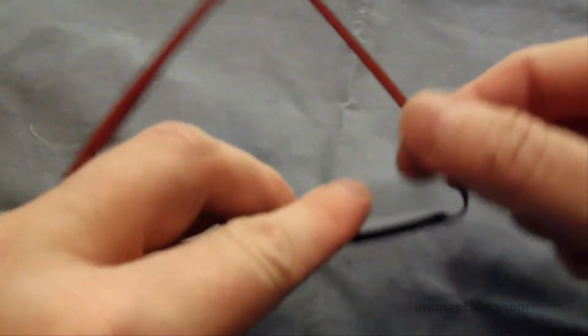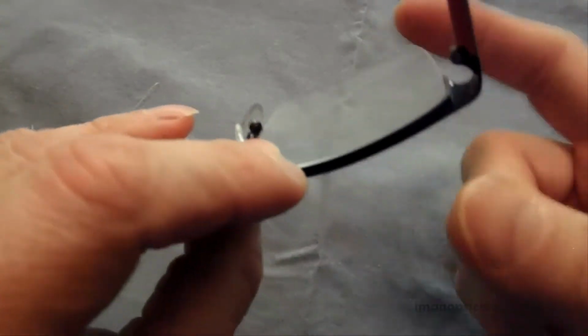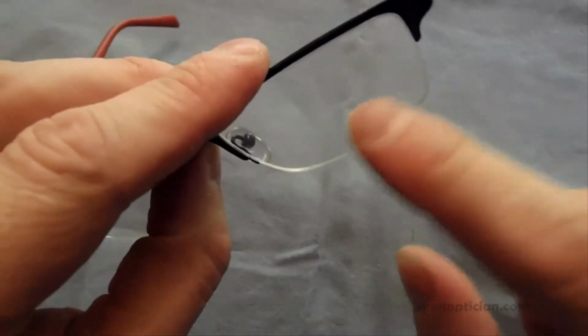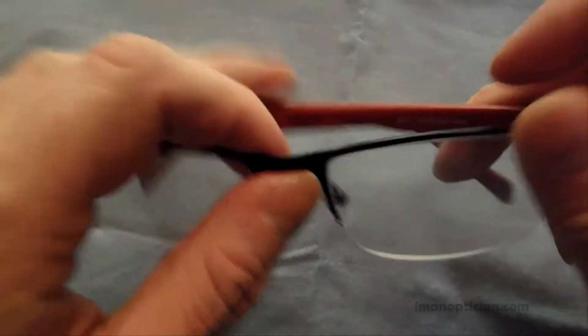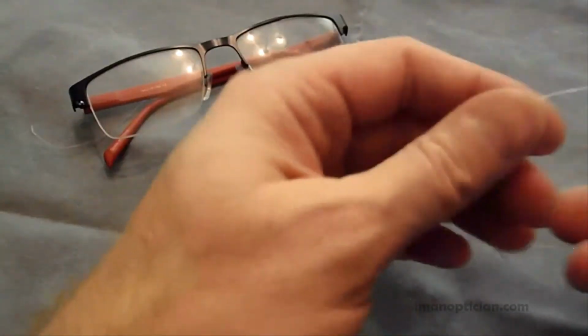Or if you have a frame warmer handy, you can just get a little heat on here, just turn that frame warmer on, stick that underneath, and this will shrink right up and be nice and tight. You can actually do that with the lens right in there if you want. If you don't want to take a chance on crazing the lens, you can pull the lens out and shrink that up. If you don't have a frame warmer handy, you can actually use a lighter.